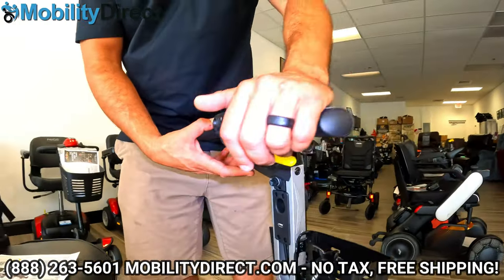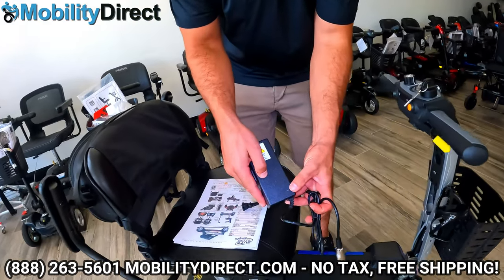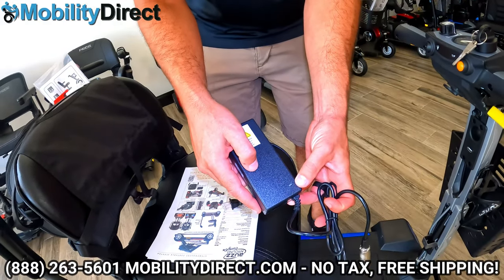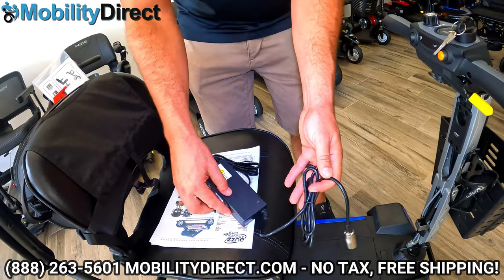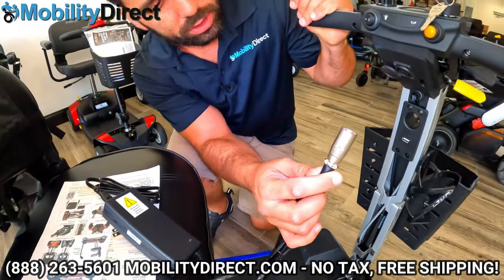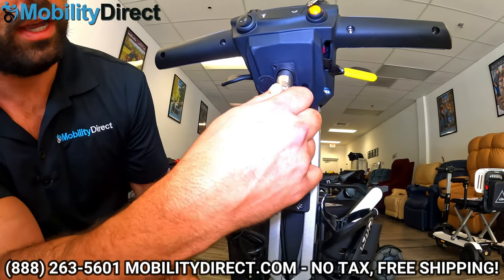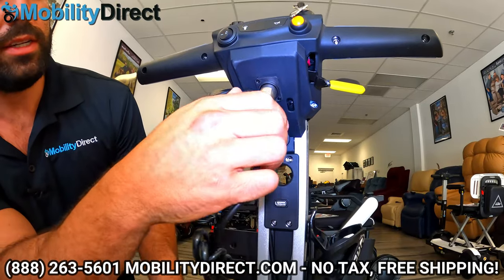Here's the charger. One end just plugs into the wall. There is a little status light — it's going to be red when it's plugged in and charging, and it will turn green when it's fully charged. This is the three-prong barrel connector known as an XLR charger. You just line up the three pins with the three holes and plug it right in. Pretty easy to use.